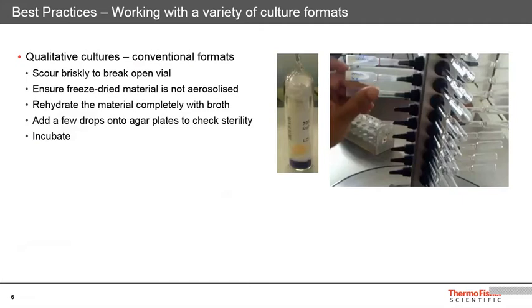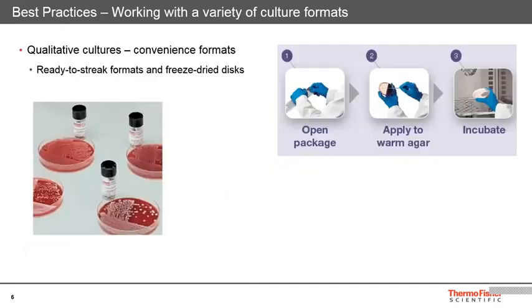Generally, you can keep the microorganism growing within 5 to 10 ml of liquid broth, or you can add a few drops of this rehydrated broth on a non-selective media plate. You can also get such qualitative cultures in a convenience format, such as the Culti-Loops from THERMOFISHER Scientific. In these loops, the microorganisms are gel preserved in a stable form for up to 18 months of shelf life.